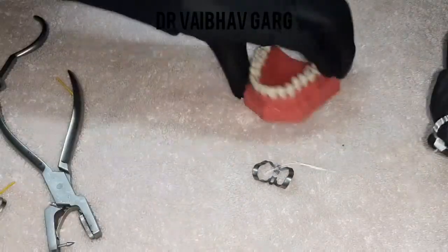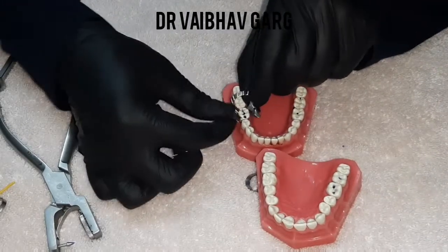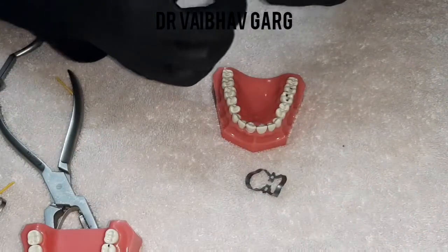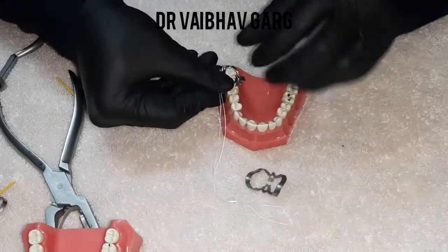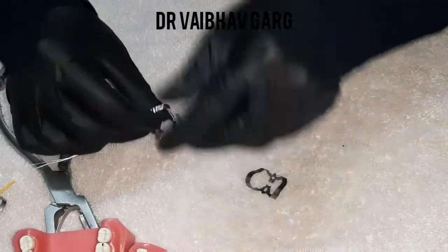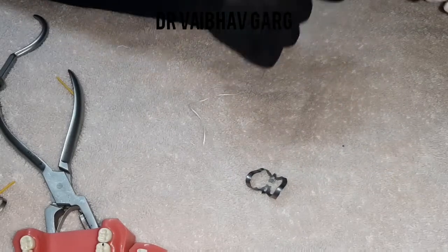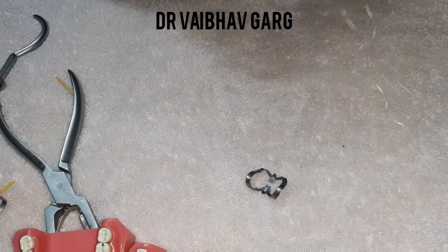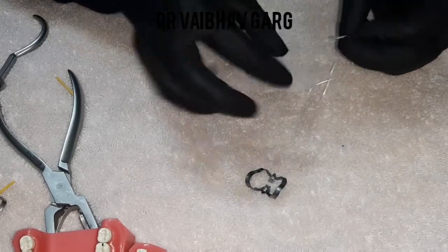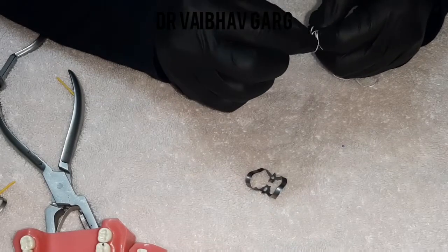The loose end should be placed on the buccal side of the clamp. There is one more thing — due to restorative procedures and wide acceptance of rubber dams, and especially during difficult times of COVID, rubber dam has become a basic norm in all situations. I am now teaching you how to make a floss tie.